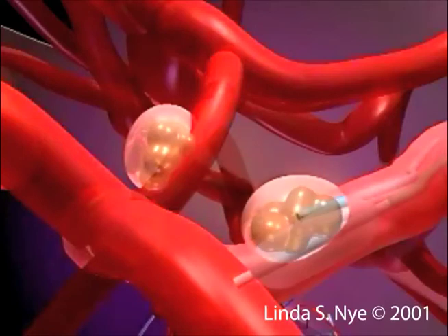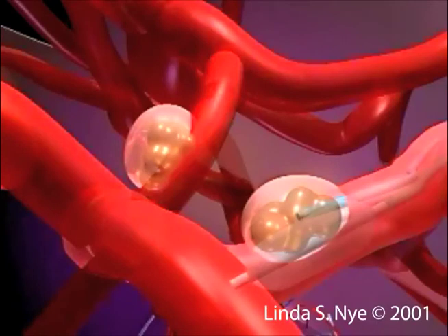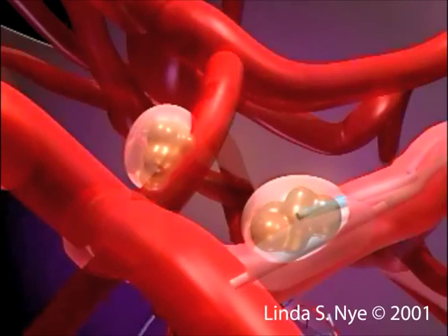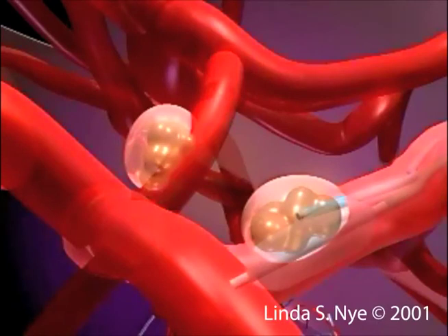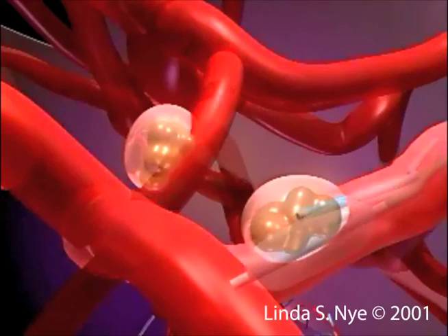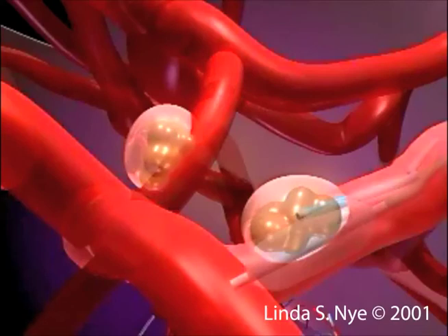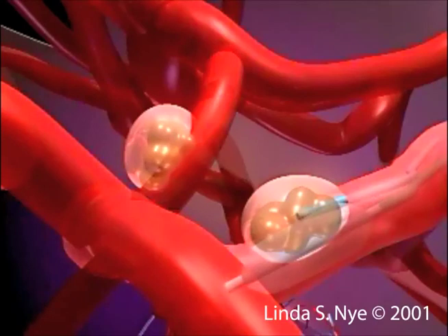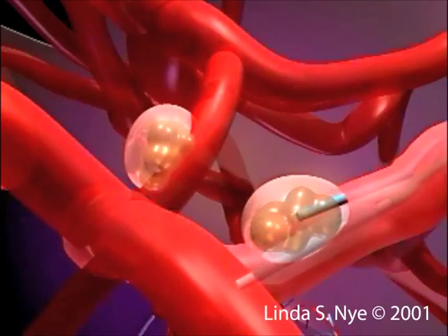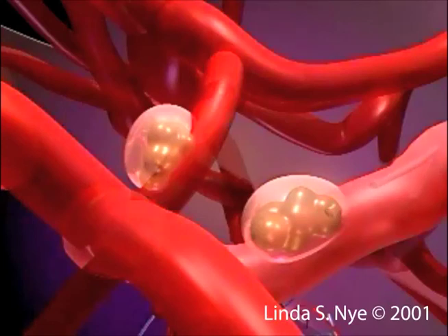The ultimate goal for NeuroKryl A is to promote the regrowth of a healthy blood vessel lumen wall. The balloon catheter prevents the product from migrating during polymerization and assists in remolding the vascular structure. After product delivery, the balloon catheter is deflated and removed along with the microcatheter.